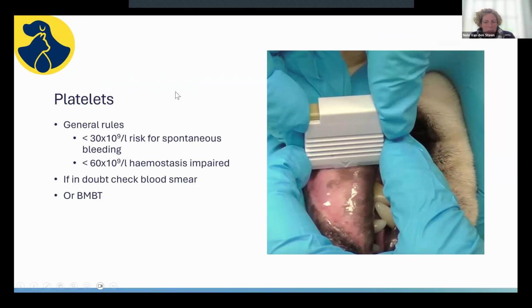So as a general rule, when we look at platelet counts, a few things to remember. Platelet counts are often difficult to count in a machine because depending how easy it was to take the blood and how well you mix it with EDTA, and if it wasn't a completely fresh sample, you might get some clots happening, even a large clot you can see in a tube, or smaller clots you cannot see, but that will stop the machine from counting these platelets.